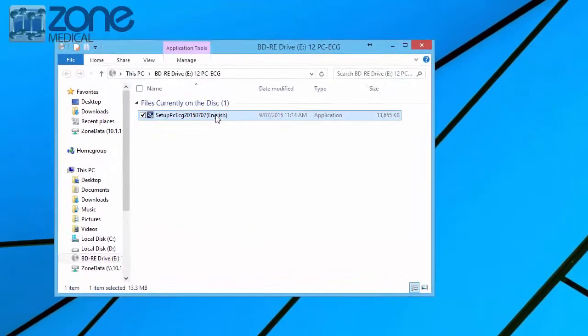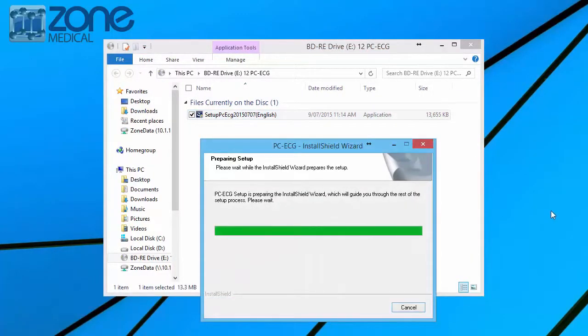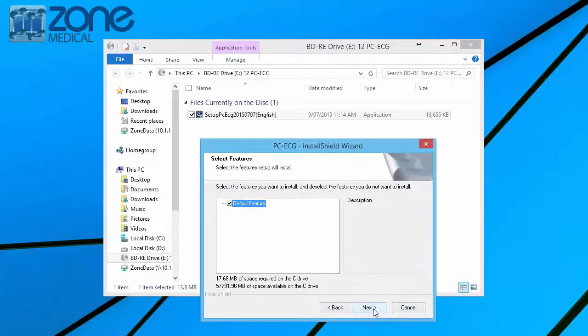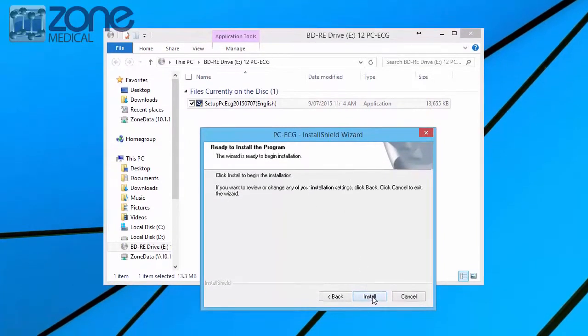Once this is done, you can click to open the CD contents of the software and press continue. You'll also need to agree to the terms and conditions to install, so press accept and then next. The installation process may vary depending on which Windows you are using, although they are all very similar and very easy to install.